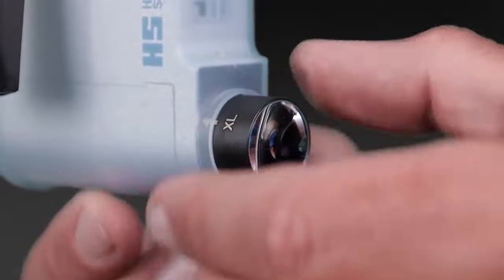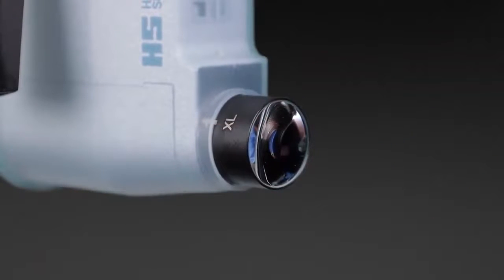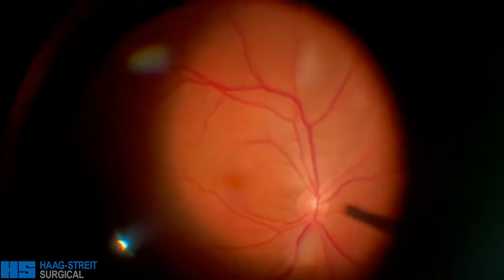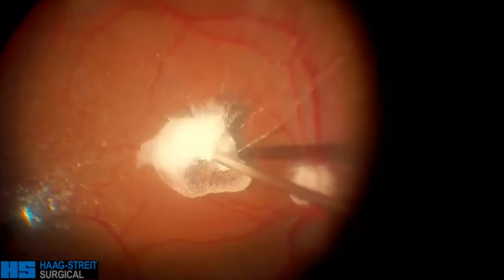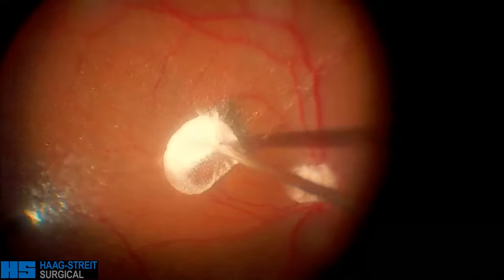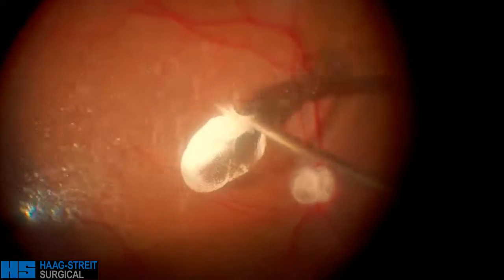Two lenses are available for retinal procedures. The wide-field SPXL lens with 132 diopters and 124-degree observation view. The high-quality optics allow excellent vision to the periphery of the visual field.